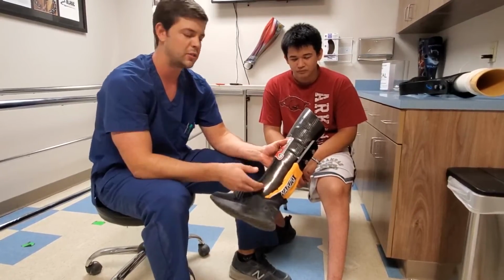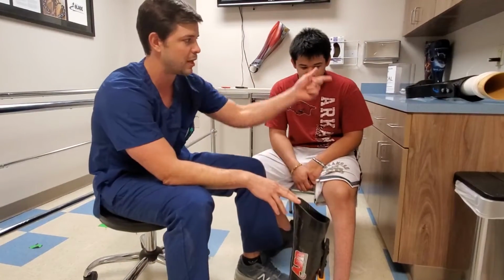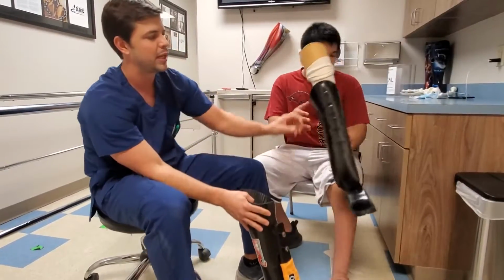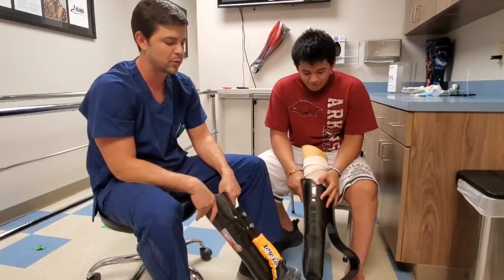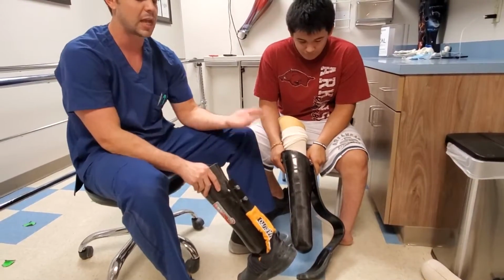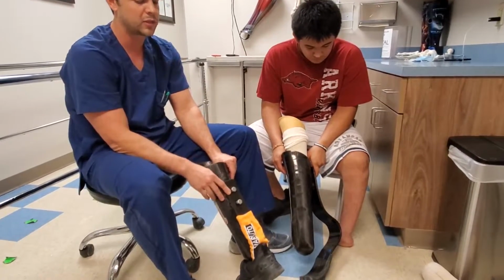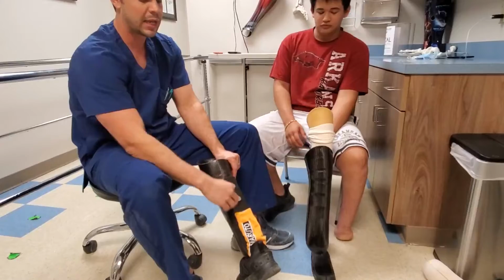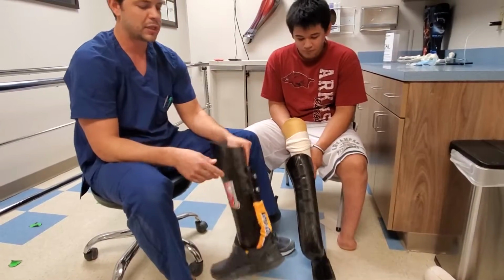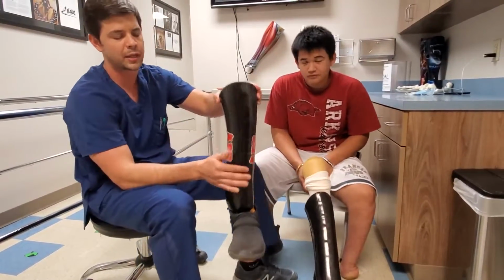He can run on this, he can do any sports he really wants to, but because he is in track, we've also provided him with a running blade. This is the same foot and blade he received 2 years ago, so all we were able to do is take it off his old socket, realign it, attach it, accommodate the different height changes, and reuse the same foot. So these feet are really nice to swap in and out. You can even make height changes as needed, and it's been good because he hasn't broken anything yet, so all we had to do is tune up the socket.